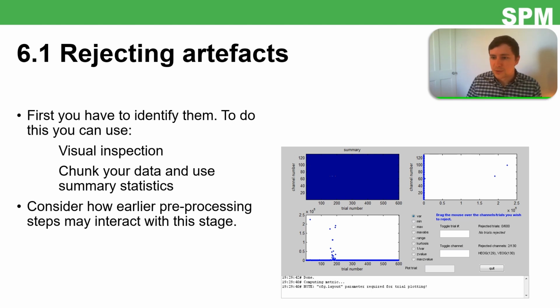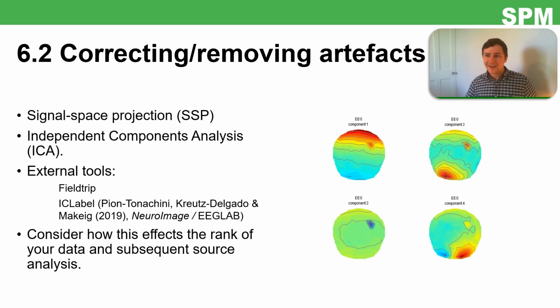So in this sense you could say, I plotted the kurtosis of all trials and I removed trials with a kurtosis of greater than X. So you can do that, and then you can use that to just reject any data. Fine. But what do you do if doing that would be impractical? So you've got some one-shot learning paradigm or something like this, and you don't want to remove too many trials.